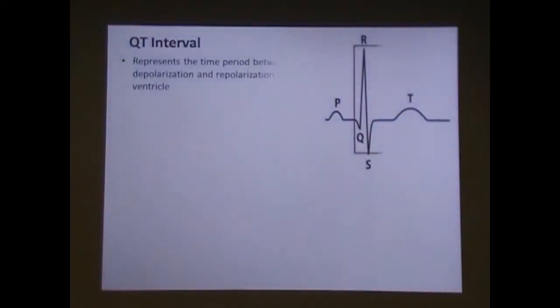QT interval. I've got a nice, quick, easy way for you guys to cheat on the QT interval in a minute. It represents the time period between depolarization and repolarization of the ventricle.